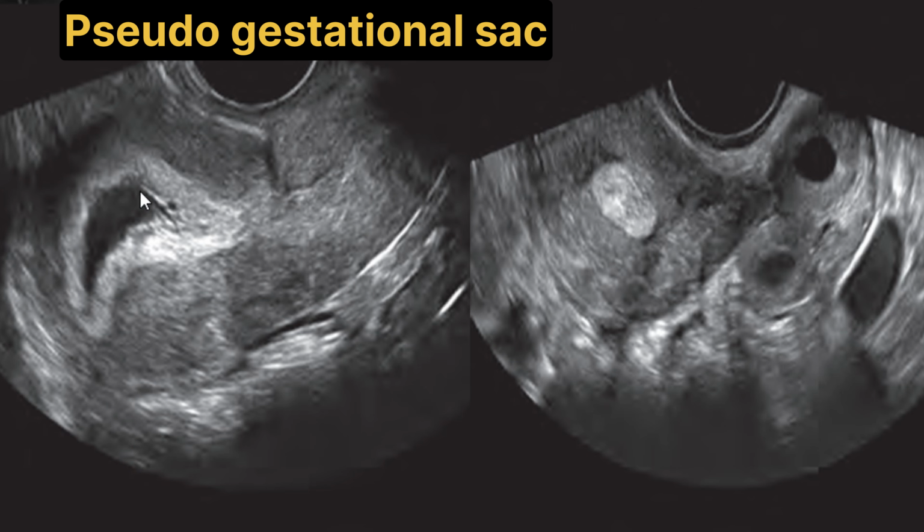Sometimes we can see a pseudogestational sac that is secondary to an ectopic pregnancy. This is a longitudinal transvaginal image of the uterus, and it shows a fluid-filled collection in the uterine cavity with no yolk sac or embryo. This fluid-filled collection is a pseudogestational sac, and it is due to the hormonal effects of the ectopic pregnancy on the endometrium rather than a true intrauterine gestational sac. And now here we can see a scar from a prior cesarean section, which is also identified in the lower uterus.